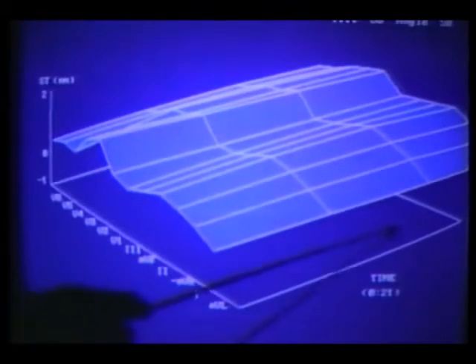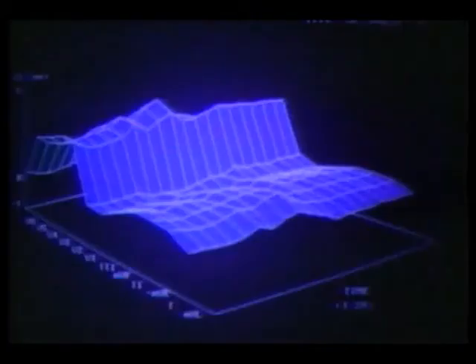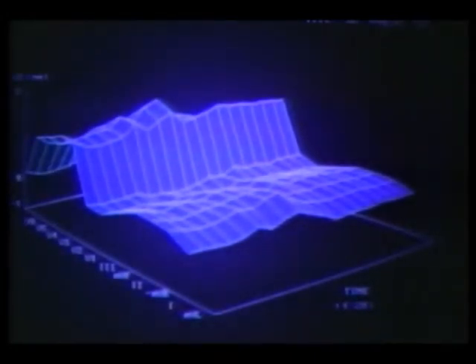We would like to review the ST segments of this patient. Our ST segments on our protocol are monitored by the Matora monitor, which is a 12-lead ST map that is plotted over time. This is a normal patient. This is an abnormal patient of an anterior myocardial infarction, untreated. Notice the magnitude of ST change and the fluctuation of ST segments over time.